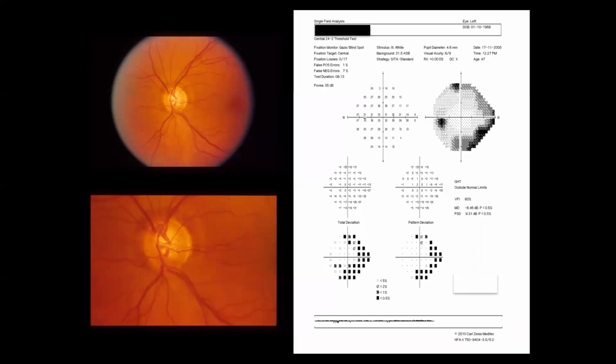We can also comment on the pupil diameter for this patient and the age of the patient as for follow-ups and to see how the machine tested based on the demographics of the machine. And you can see that the fovea is on for this patient, and we can go ahead and proceed to see the grayscale of the patient.